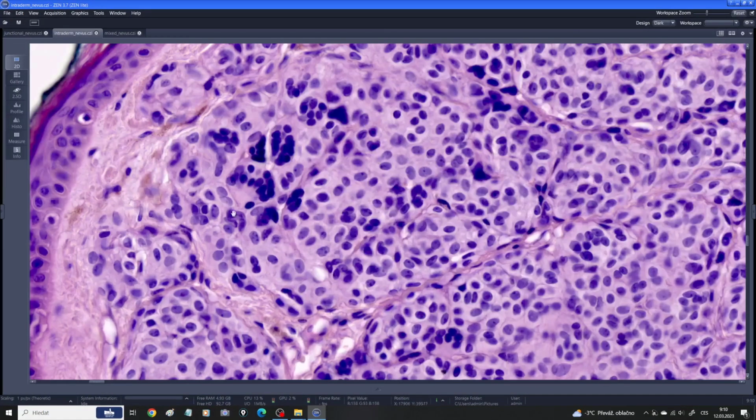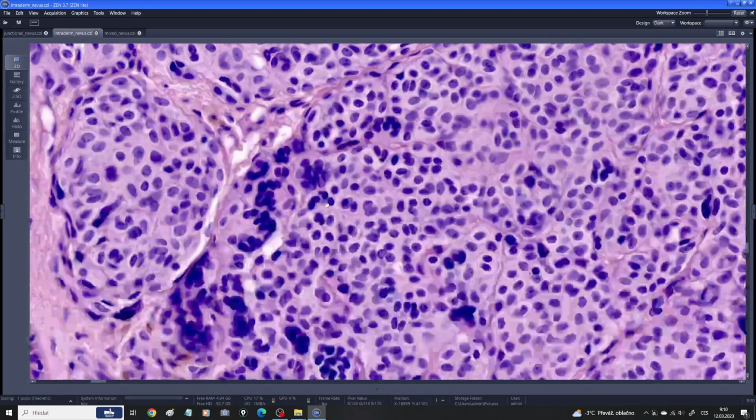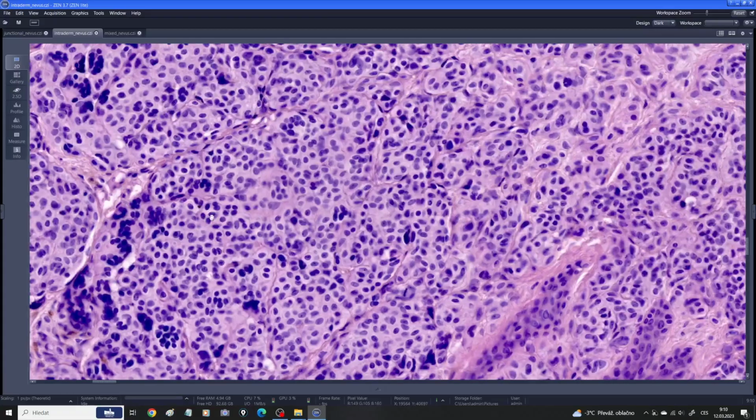Please don't be scared of those guys. Those are multinucleated melanocytes, and this is quite common in benign nevi. So this is not a sign of malignancy. Those floret-like cells, those multinucleated melanocytes, are quite common, and not necessarily a sign of malignancy. So don't be worried by this.